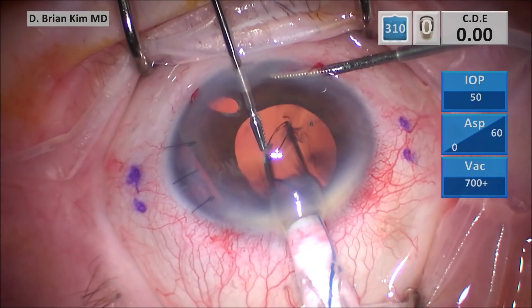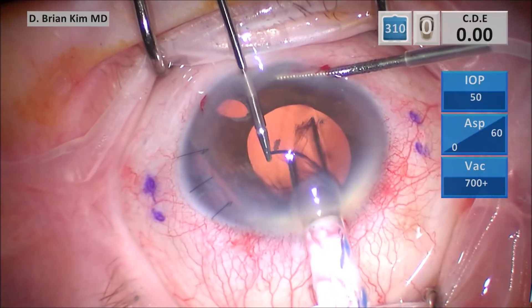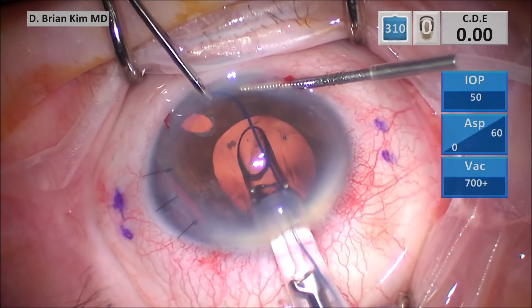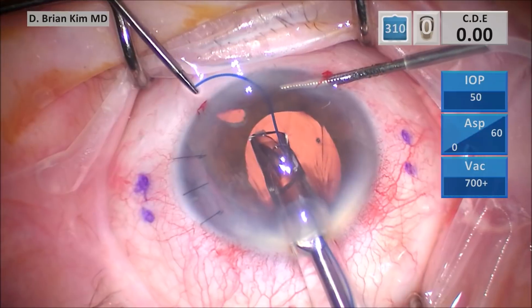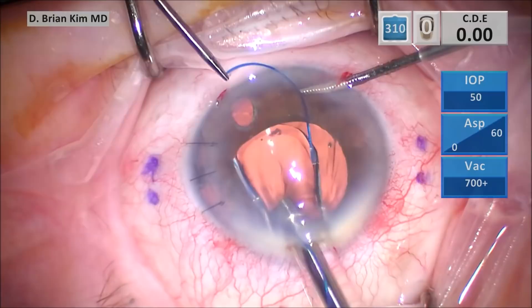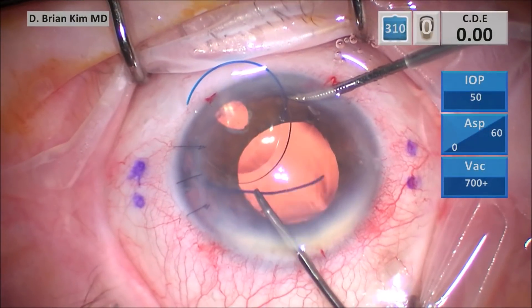This is going to be the CT Lucia 602 lens. It's being injected and pushed by my surgical assistant. As she's advancing the IOL, I'm going to pull the leading haptic out of the inferior corneal incision. This helps make sure the lens doesn't fall, keeps the lens in a more anterior position, and gives me better access for the trailing haptic.